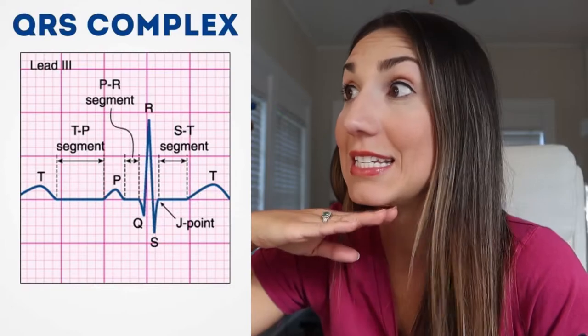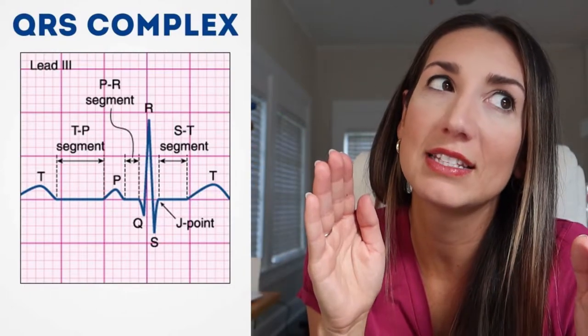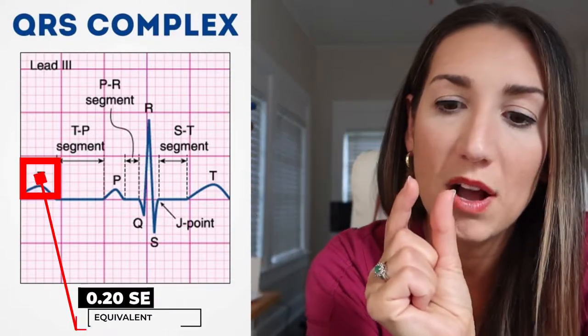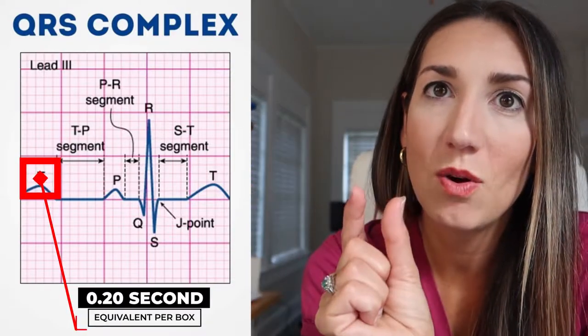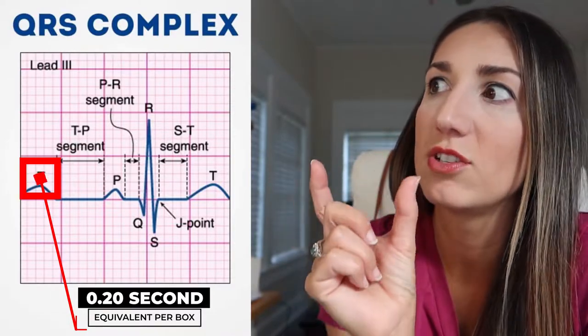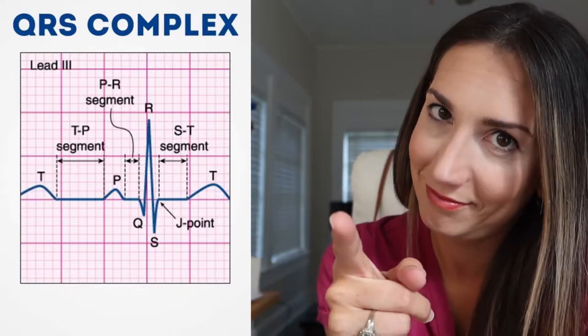to calculate it. Now when you're looking at an EKG and it's like graph paper, with all those tiny square boxes, each little square box is 0.04 of a second. So that's how you would calculate the PR interval, the QRS duration, and the QT interval. All right, so let's talk about quick EKG readings when you're looking at the actual EKG. So now you know how to measure each little thing, how to find the rate.